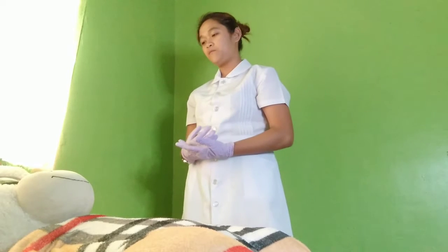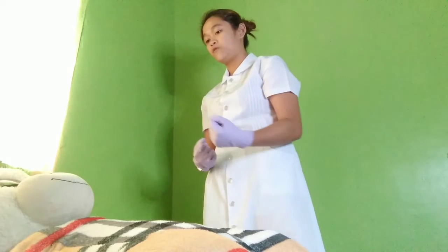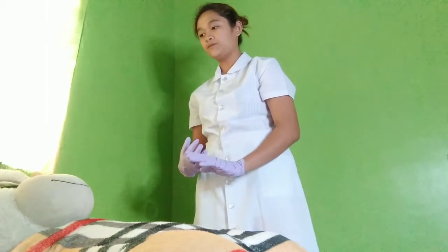Hello, good day ma'am. I am Angela Maylino, your nurse for today. What is your name? Okay, good. And what is your birthday? Okay. Ma'am, may I remove your blanket and check your stomach?